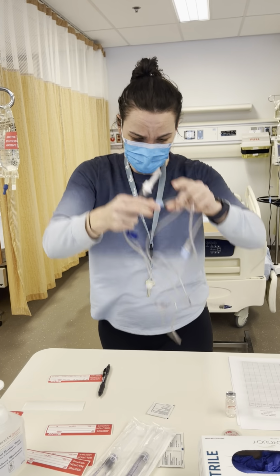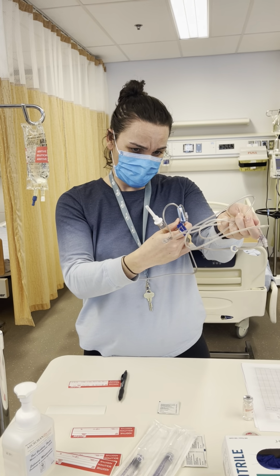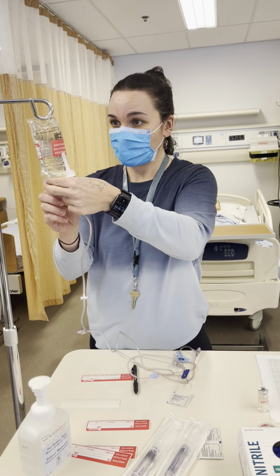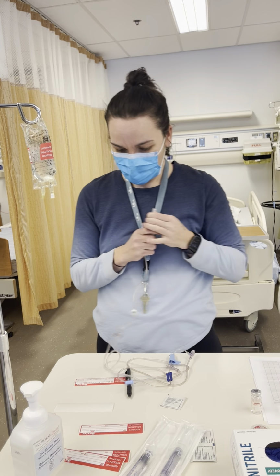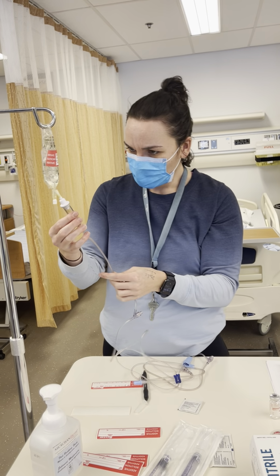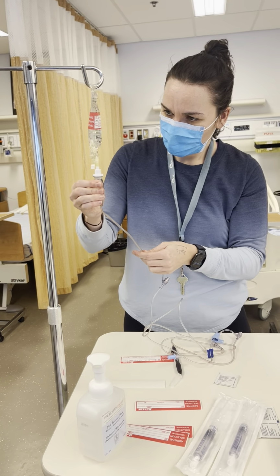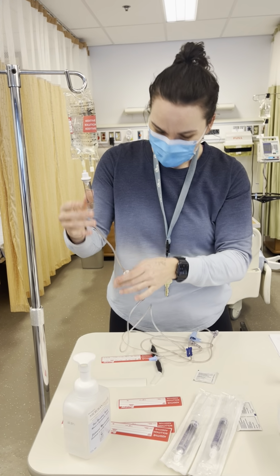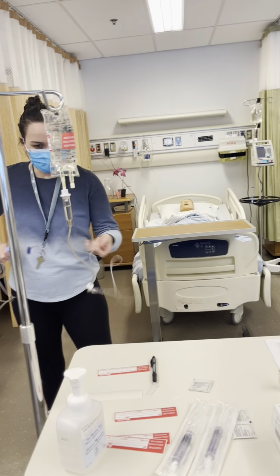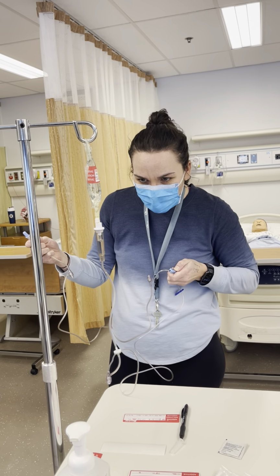That's good. Just make sure everything's in order. And we will spike our bag, and we can fill up our chamber a bit. There we go. And now we're going to try and do this slowly so we don't waste any. So we'll just open up our clamp.